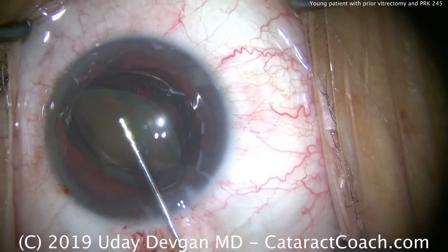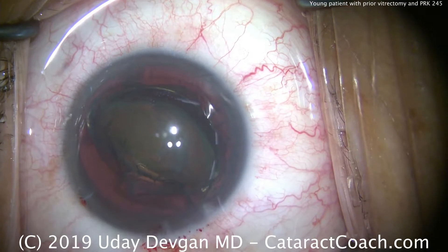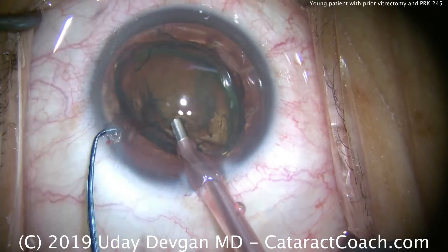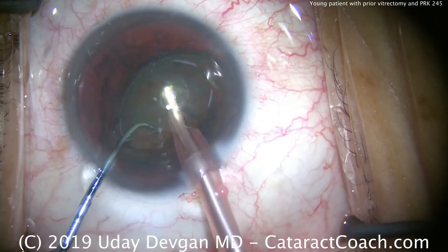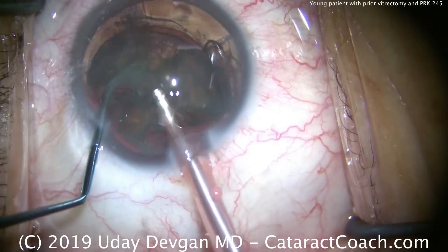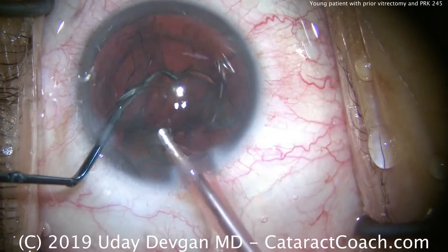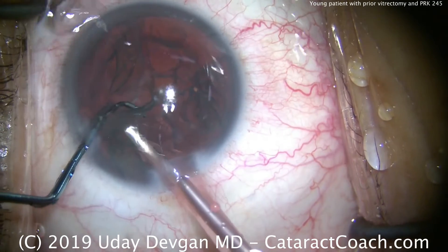The key here is to get the nucleus out of the capsular bag. This patient has two reasons to have an overly deep anterior chamber: prior vitrectomy times two, and a very long axial length from axial myopia prior to PRK. The chopper is used to push nuclear pieces toward the phaco tip. We don't really need to chop the nucleus because the patient's young and it's not dense. Importantly, keep the chopper in a protective position — do not let the capsular bag come forward. You must protect the capsular bag at all times.